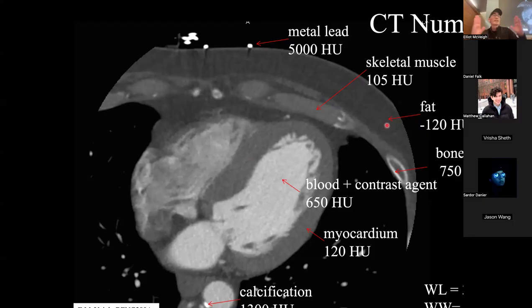And I'll show you. You just narrow down the width of values that you're going to display such that things above it all turn white, things below it all turn black, and then you see contrast in those regions. Here we've put the contrast such that we really want to see the details in things that are way up at 650, so it's wide open.